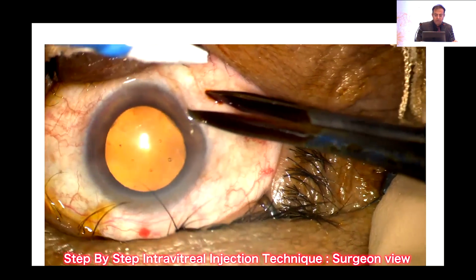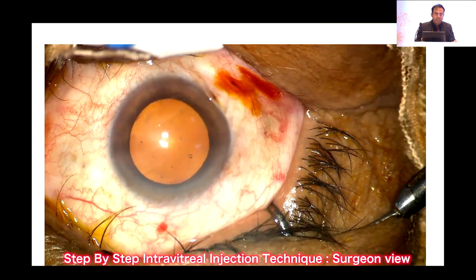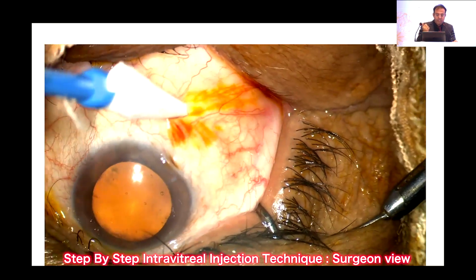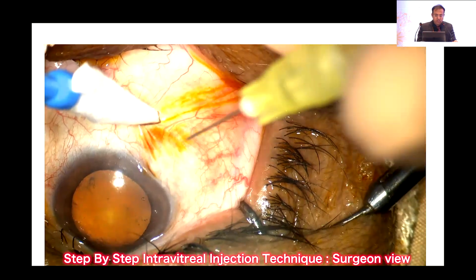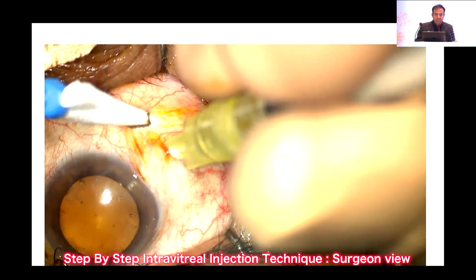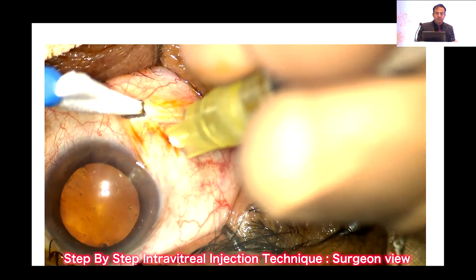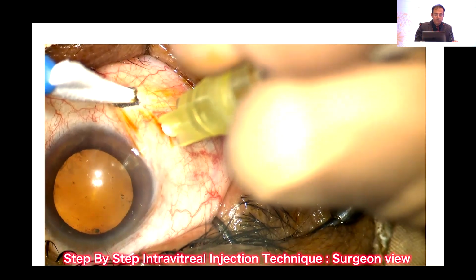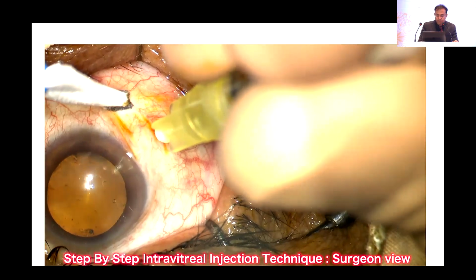Now the site of injection is not important. Whatever is comfortable, wherever you feel that you can easily give the injection, because there are patients who are going to look in the upward direction. There are patients who look in the downward direction. Sometimes it is not very easy to do it in a particular quadrant. So whichever is more visible, you can do.